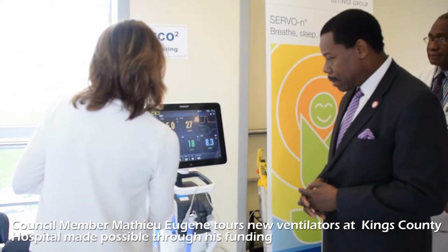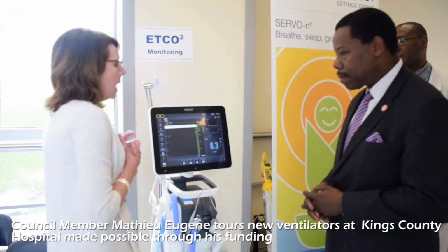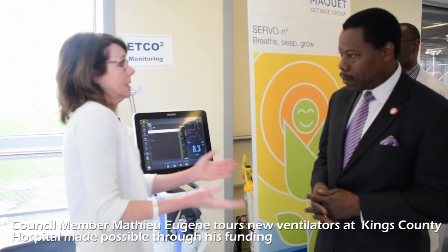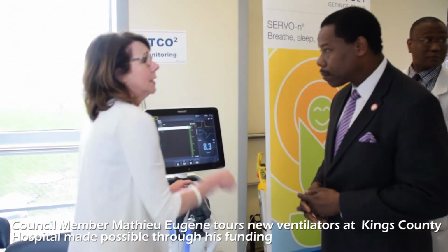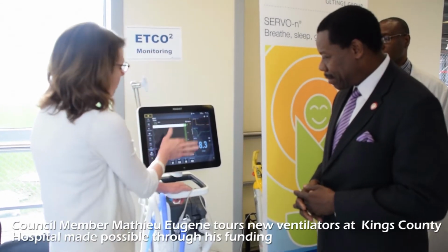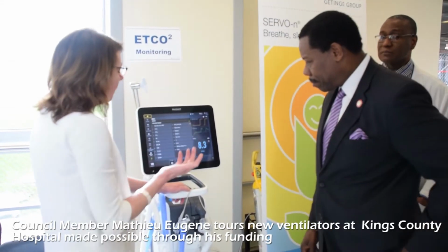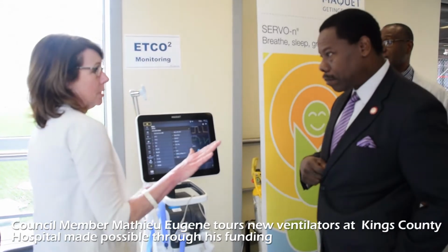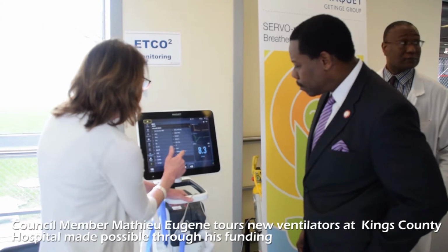They can also trend all the information that they want. Depending on what's wrong with the patient, we look at different things. So with this, trends are really great. I didn't just start the ventilator, so there's not a lot of lines across it. But you feel like you're doing this forever and you can't find it. So the doctors can come here and easily, and respiratory, of course, because the respiratory therapists are really the experts on the machine, can easily do it. This works like an iPad, as I told you.